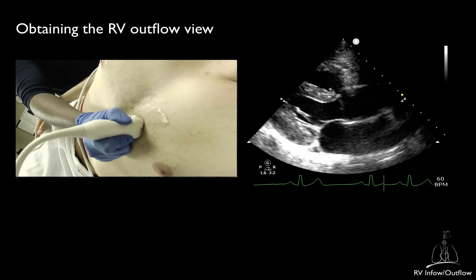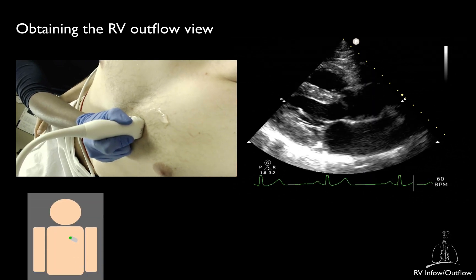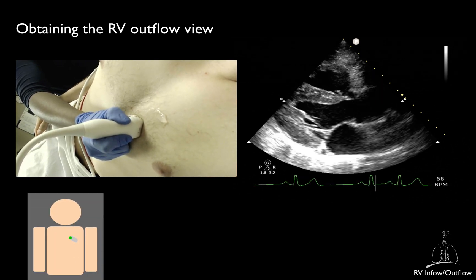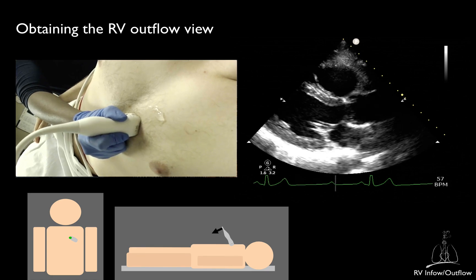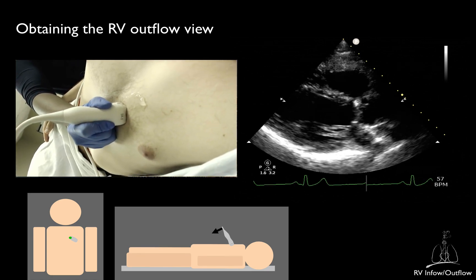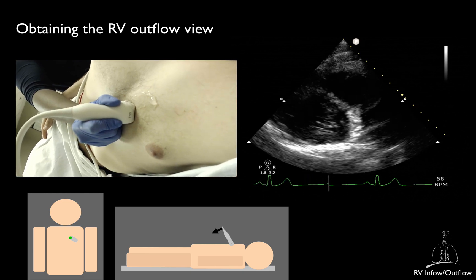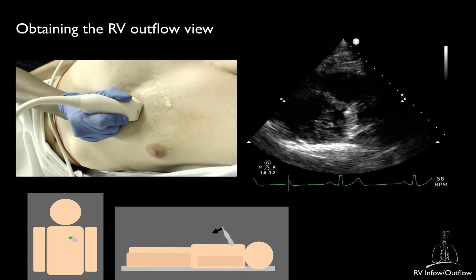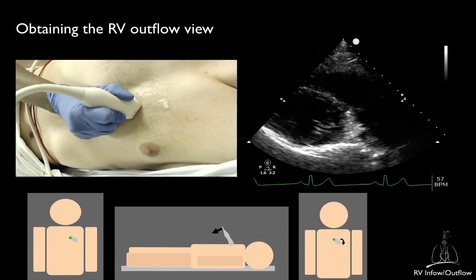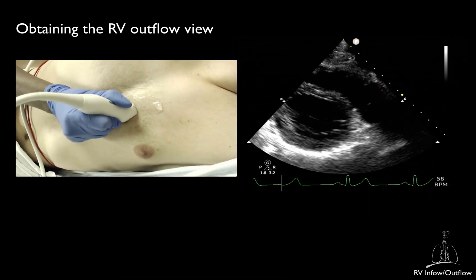To obtain the right ventricular outflow view, go back to the parasternal long axis view and then continue to tilt the transducer tail downward — that is, direct the ultrasound beam upward. Sometimes, a slight clockwise rotation of the transducer may help in better identifying the right ventricular outflow tract.